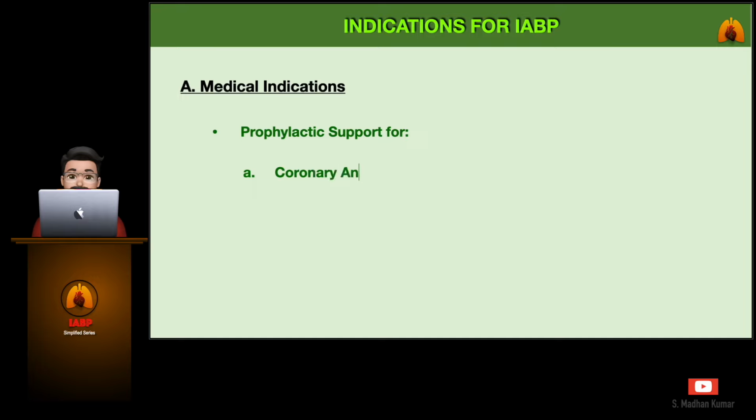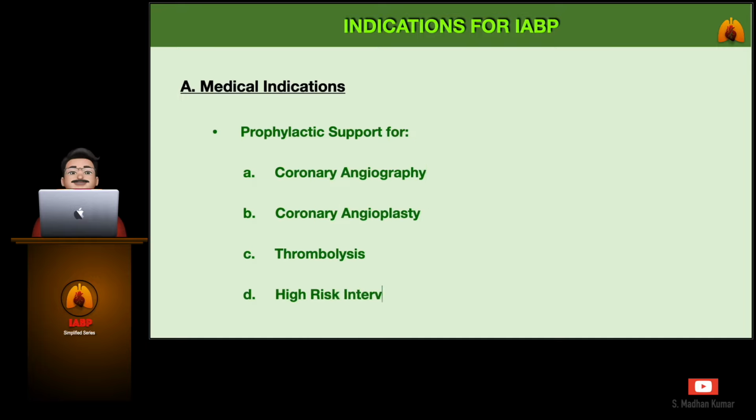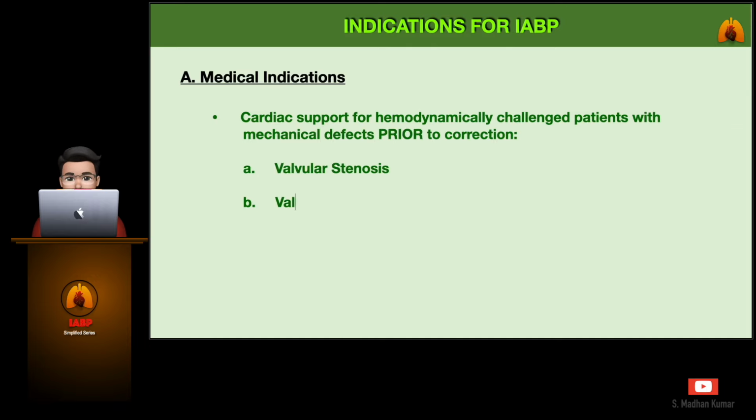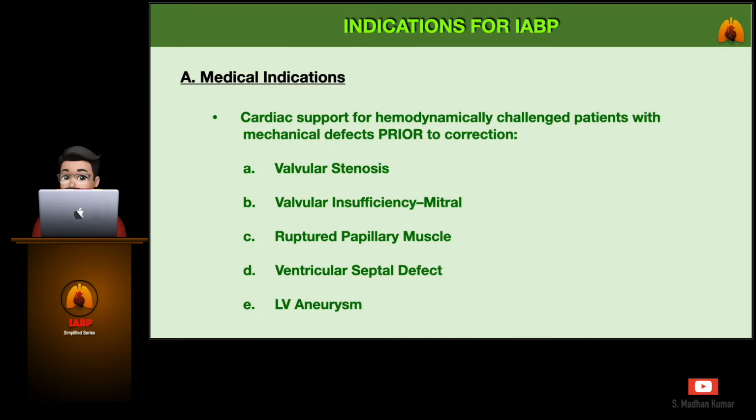Prophylactic support for coronary angiogram, coronary angioplasty, thrombolysis, and high-risk interventional procedures like stent insertion. And cardiac support for hemodynamically challenged patients with mechanical defects prior to correction of valvular stenosis, valvular insufficiency, ruptured papillary muscle, ventricular septal defect, or LV aneurysm.